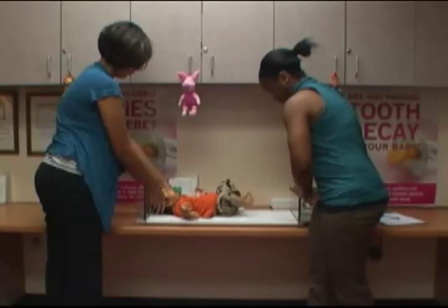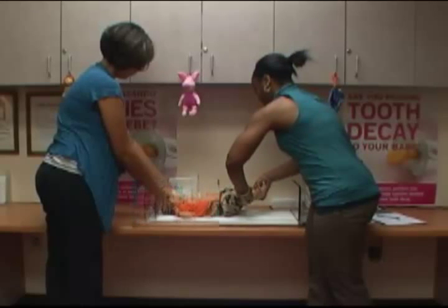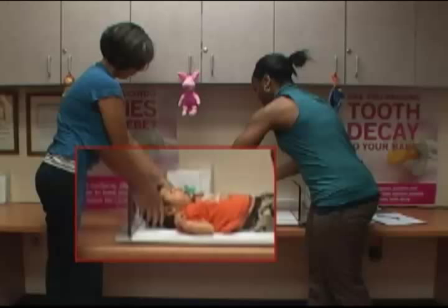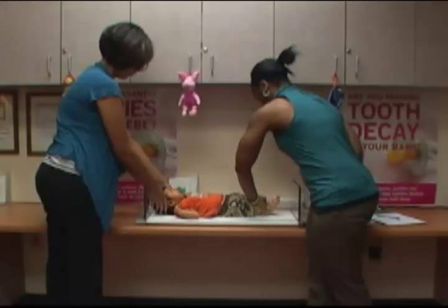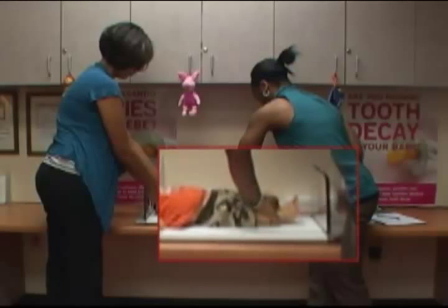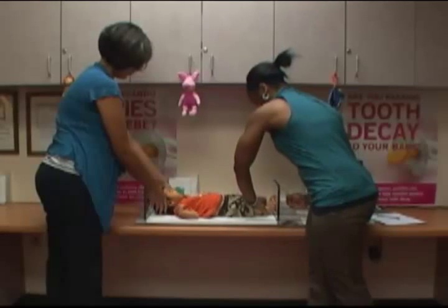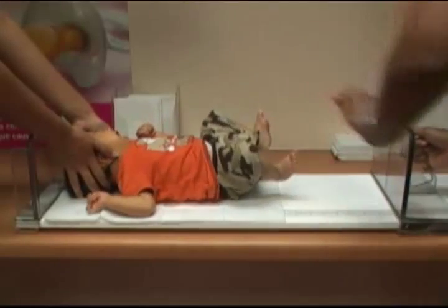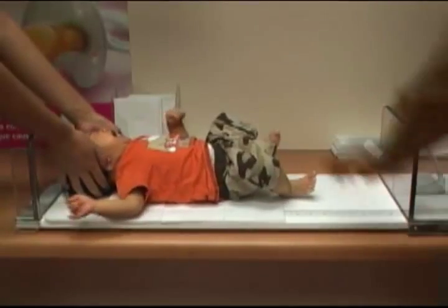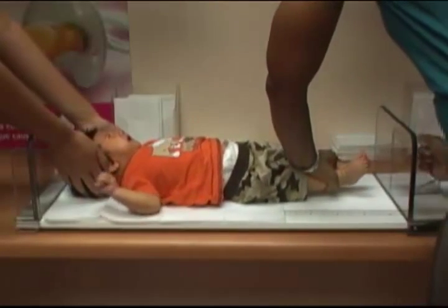The caregiver will then gently place the child flat on his back and hold the child's head firmly against the headboard by gently cupping their hands over the child's ears. You can then bring the child's legs together by holding both of the child's ankles with one hand. Use your hand and arm to gently push down the legs and straighten them out, making sure the child's head is flat against the headboard and both legs are straight. You can then slide the footboard flat against the bottom of the child's feet using your free hand.